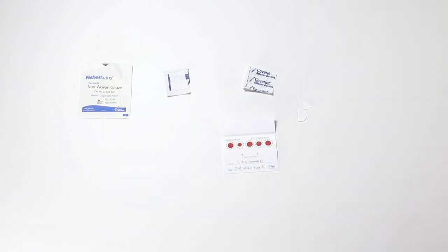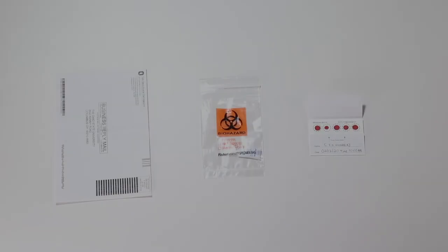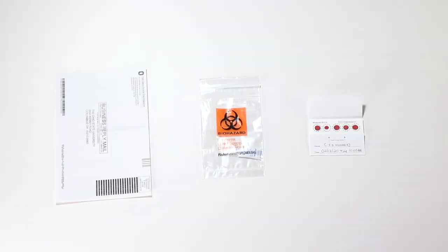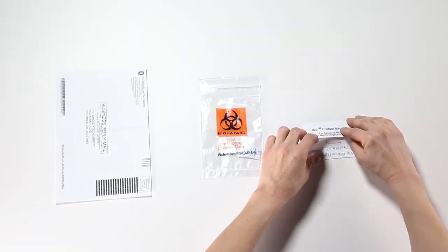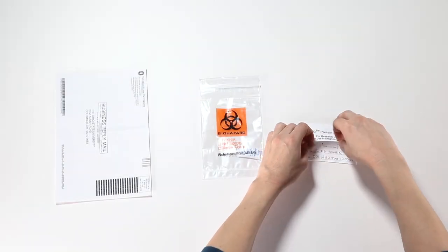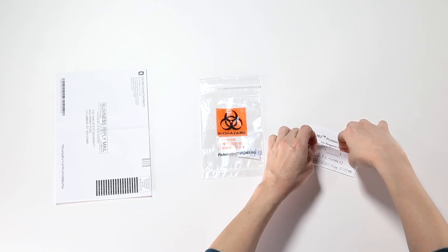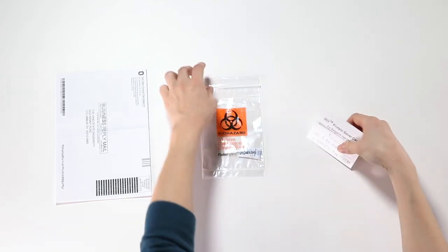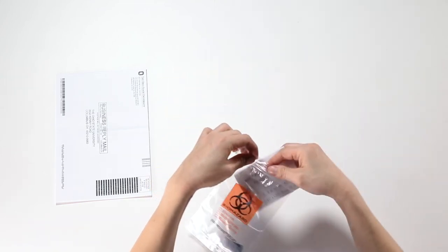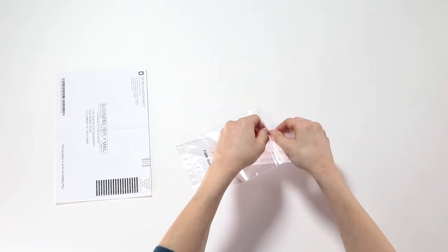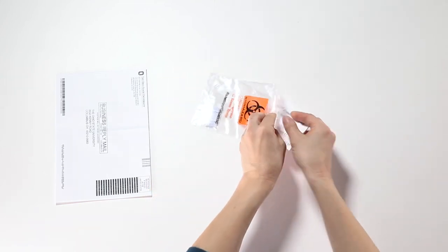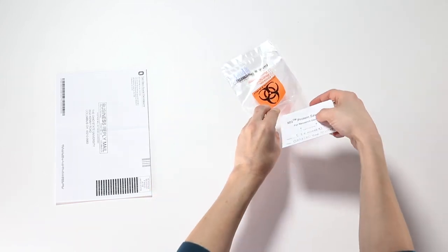Let the collection card sit for at least four hours or up to overnight to dry before sealing the card up. After the blood spots have dried completely, fold the card so that the blood spots are covered and place the collection card into the plastic biohazard bag with the silica gel pack.